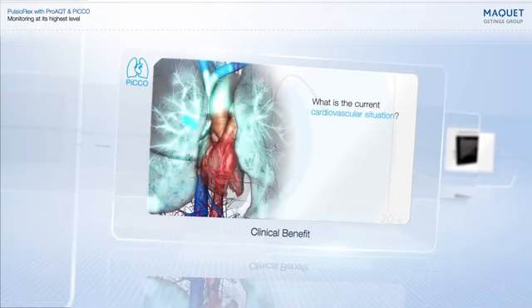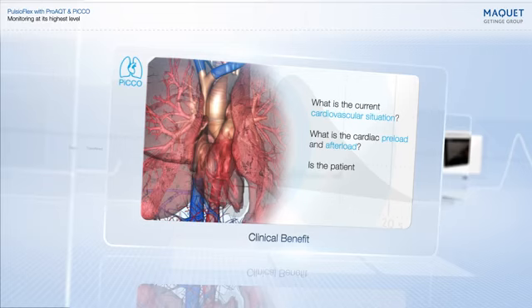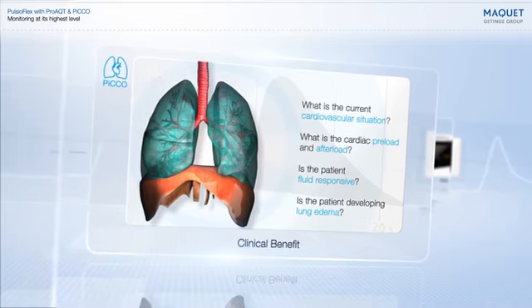What is the current cardiovascular situation? What is the cardiac preload and afterload? Is the patient fluid responsive? And is the patient developing lung edema?